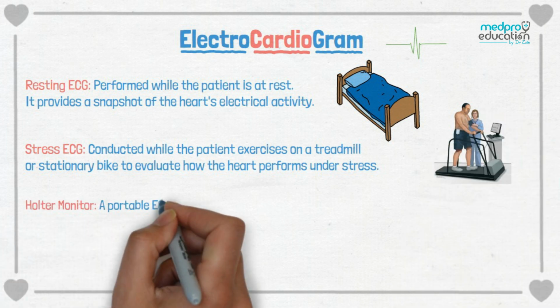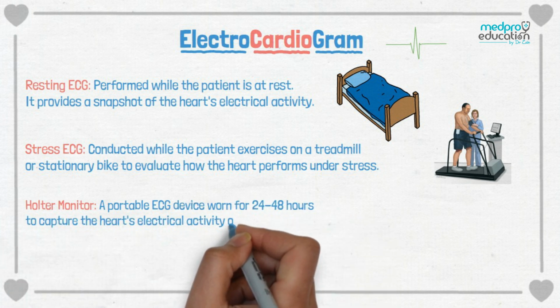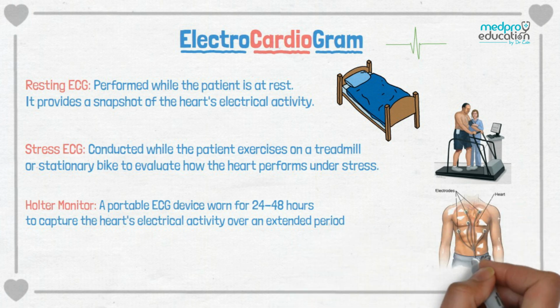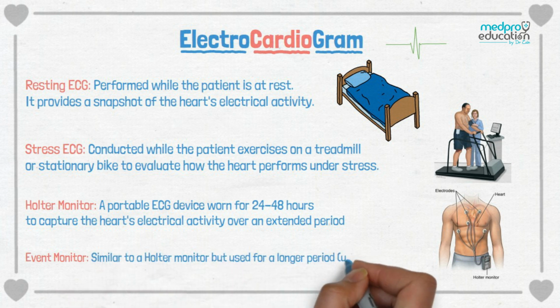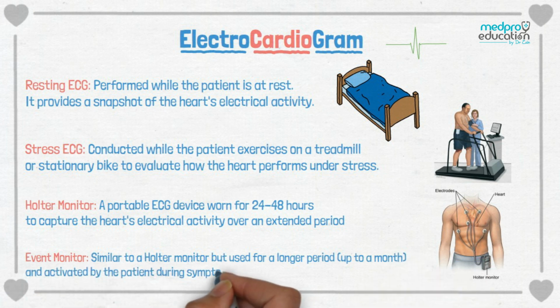Holter monitor, a portable ECG device worn for 24 to 48 hours to capture the heart's electrical activity over an extended period. Event monitor, similar to a Holter monitor but used for a longer period, up to a month, and activated by the patient during symptoms.